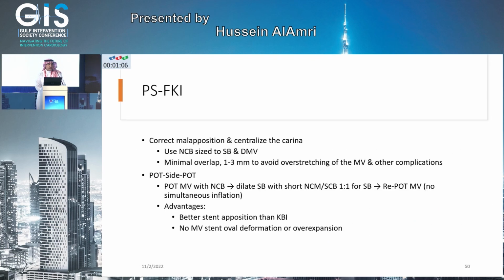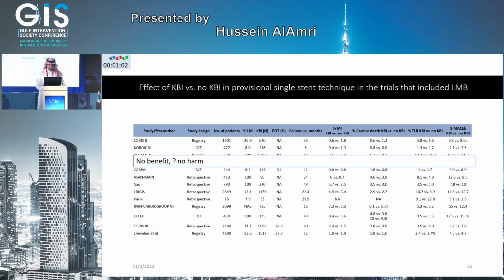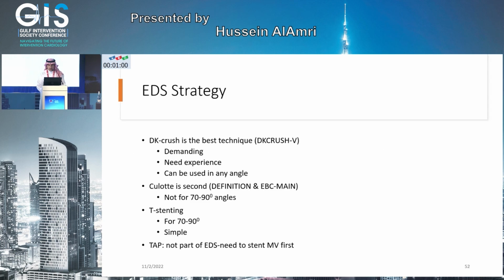Final kissing, again, there's no benefit, there's no harm, and it's not recommended. In Nordic bifurcation, there was harm rather than benefit.